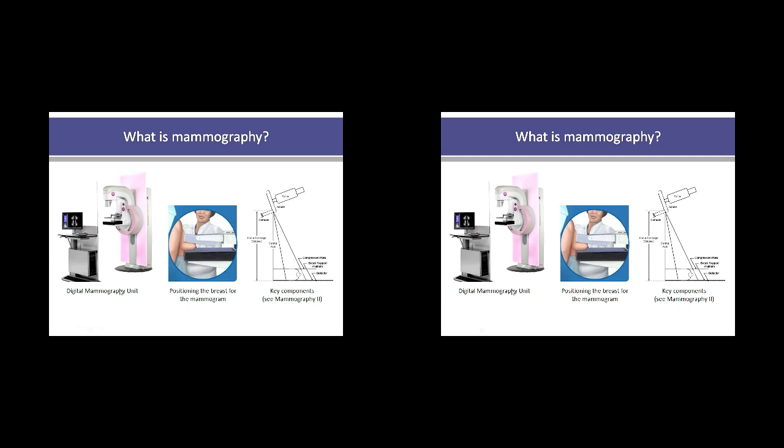So this is just a few diagrams then of mammography. I suspect you probably haven't been into a breast screening practice. You probably don't do placements in breast screen at this stage of your training, so you may not have actually seen the X-ray unit. We do use dedicated equipment. You can't just do it on any old X-ray unit. So this is what the equipment looks like. This is the Siemens model then. So we have a gantry, we have a breast support platform here, so the woman will lean into the breast support platform and will have her breast compressed, and that's quite a painful part of the procedure actually, and it does prevent women from returning for their second screening appointment.